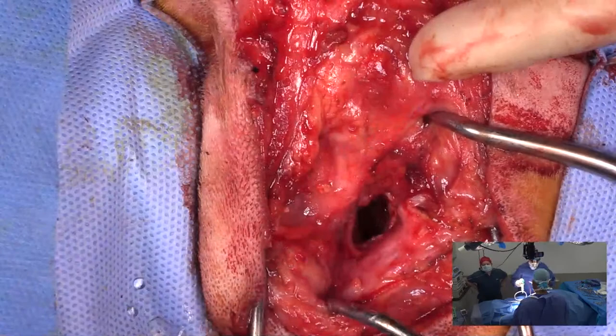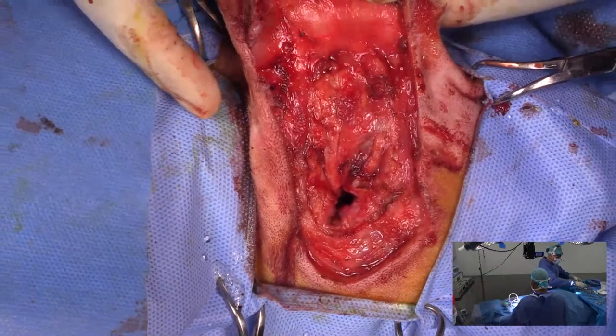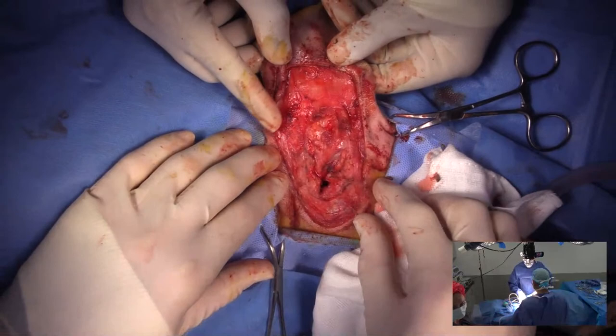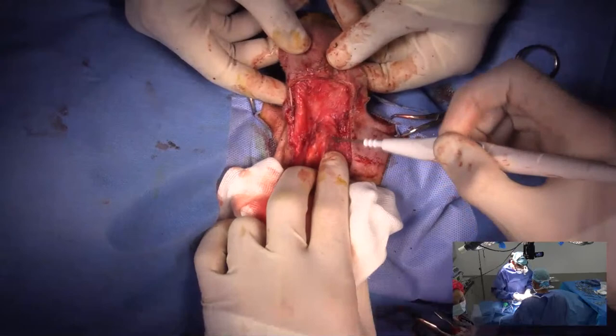We'll go ahead and zoom out again. I'll get some mepivacaine. So we've preserved our facial nerve. We've gotten all the lining of the bulla out. And so we'll just do a local block with mepivacaine, and then I'll be happy to close. This dog has had multiple cultures in the past, so I won't. If there's any question, it certainly is not a bad idea to do a culture.